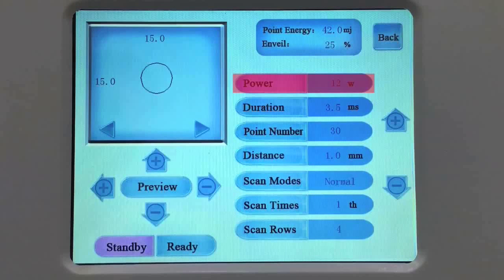Enter vaginal mode and adjust parameters. Power adjust range from 1 to 40 watts. Duration adjust range from 0.1 to 10 milliseconds. Point number adjust range from 4 to 100. Distance adjust range from 0.1 to 10 millimeters. Scan modes: Normal, Mid-split, Random. Scan times adjust range from 1 to 20. Scan rows from 1 to 10.